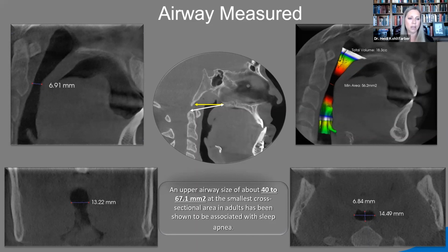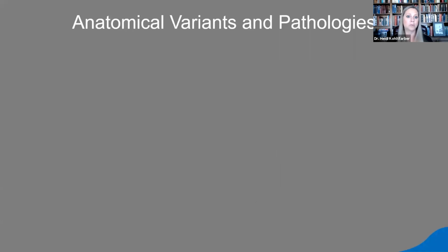We're letting this technology help us to aid Mrs. Jones in finding out whether she has obstructive sleep apnea, but our CBCTs cannot diagnose obstructive sleep apnea. The patient's got to go on for a sleep study because, again, that's the gold standard. So I do want to make that really clear.